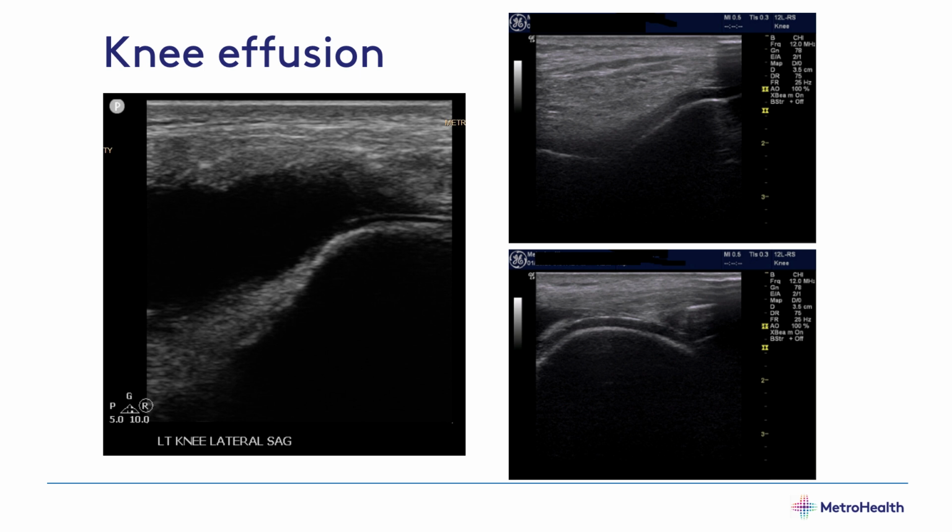Incidentally, the U.S. sonar convention is that medial, proximal, and anterior is on the left side of the screen. So all our images look the same, whether it's right knee or left knee. So anyway, here's a questionable double contour sign.